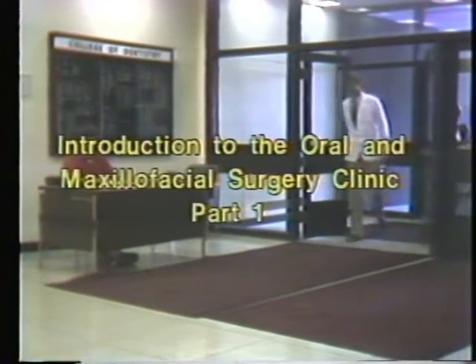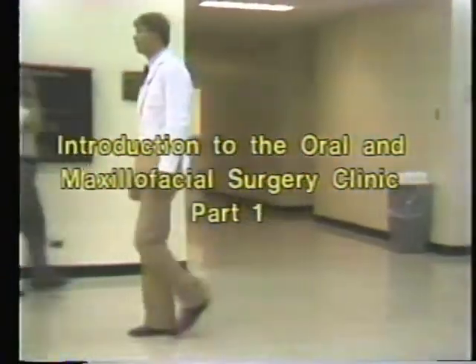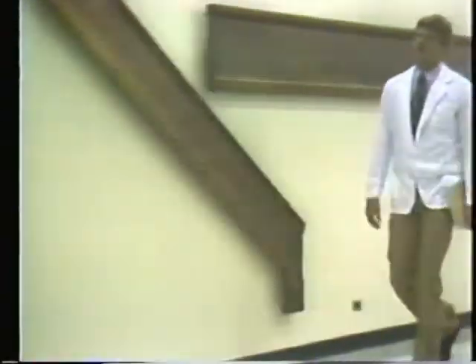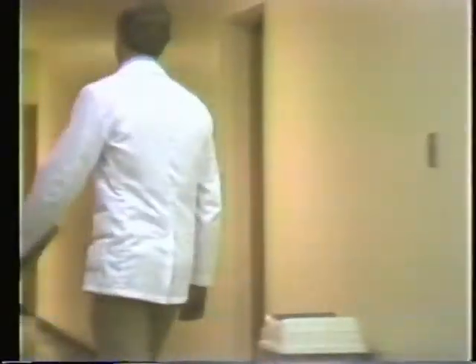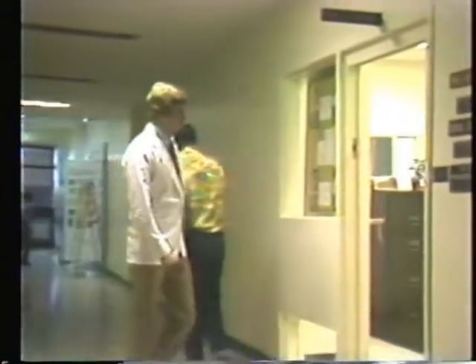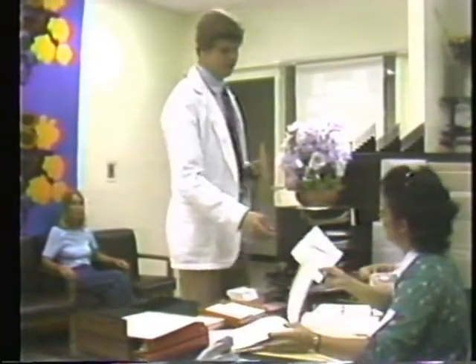The purpose of this program series is to introduce you to the protocols and procedures of the oral and maxillofacial surgery clinic facility. In this first program, you'll see the physical facilities, you'll learn about the people who work here, you'll get acquainted with the forms and procedures you'll be using, and we'll also show you the instruments you'll be using. We'll get into working with patients in the second program. And the third program will take you through an actual patient's visit to the clinic.